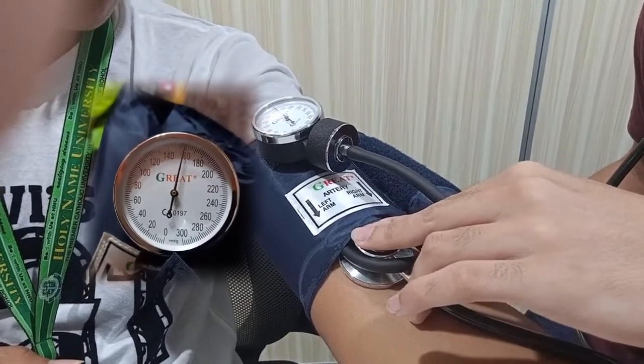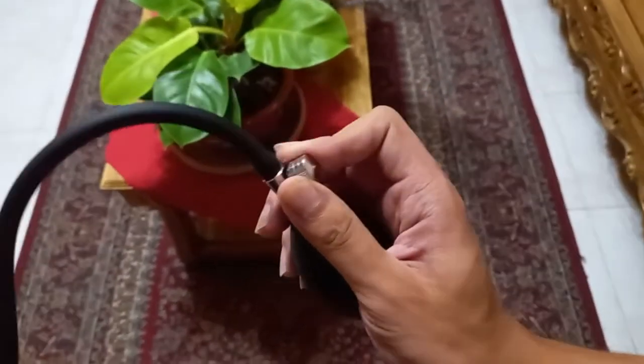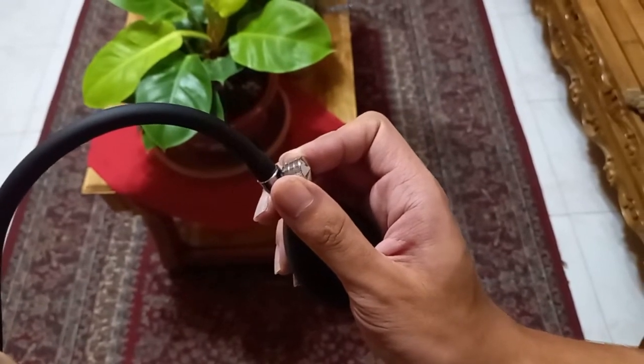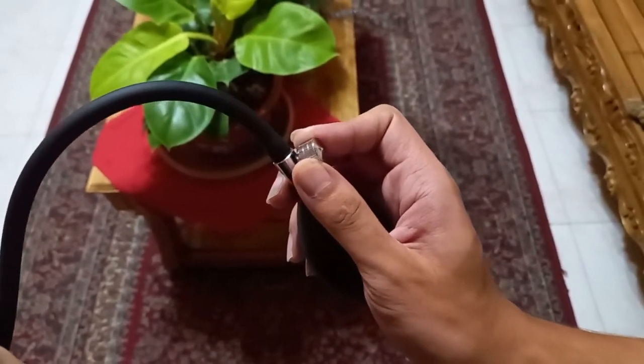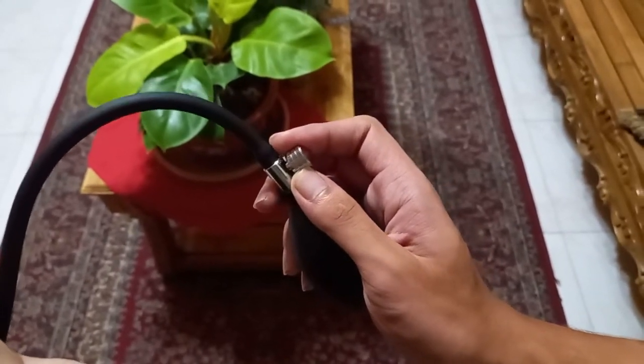Fifth, keep your eyes on the gauge. Slowly release the pressure in the cuff by opening the airflow valve counterclockwise. The gauge should fall only 2 to 3 points with each heartbeat. You may need to practice turning the valve slowly.